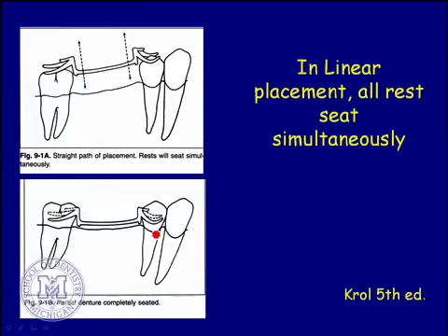And you can see in this area, you would have blocked out where that undercut exists on the mesial of that tooth and where the undercut exists on the distal of that tooth. They would have been blocked out parallel with the path of insertion. So when everything went in, it just all slides down. And then what's holding this partial denture framework to the back tooth is an occlusal rest, a lingual reciprocal arm you see dotted, and a buccal clasp arm.